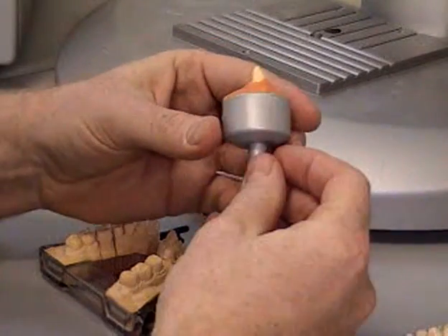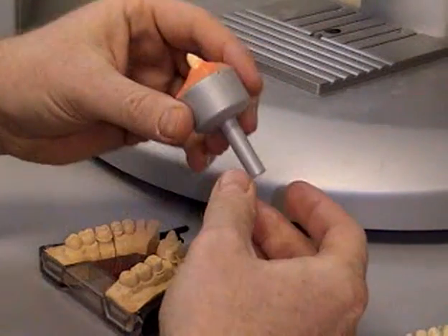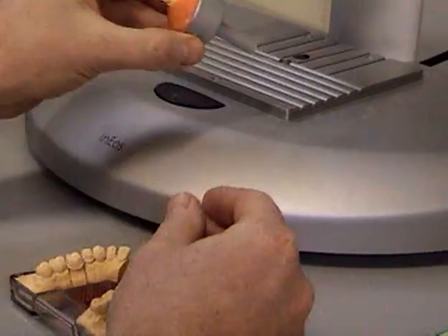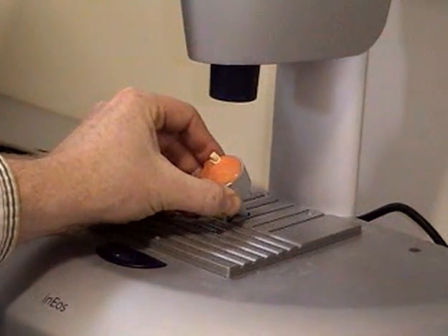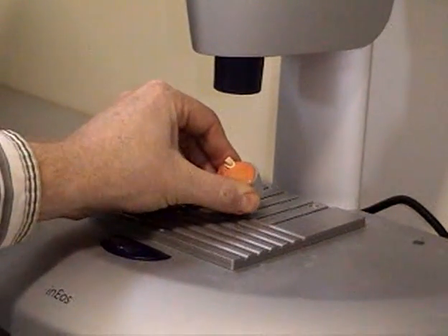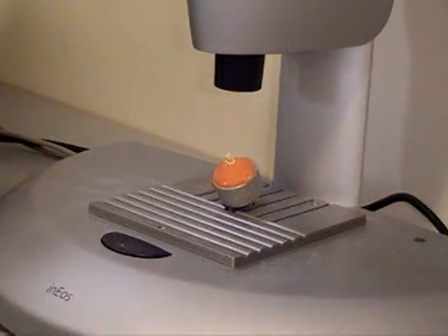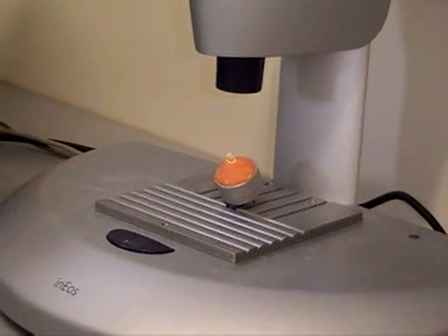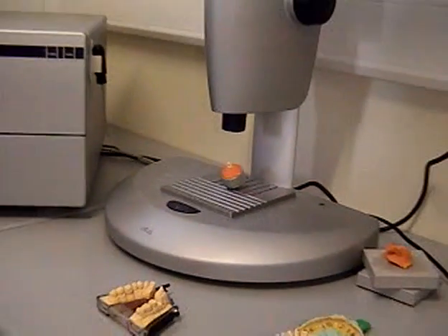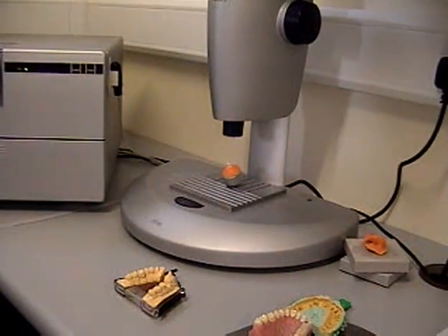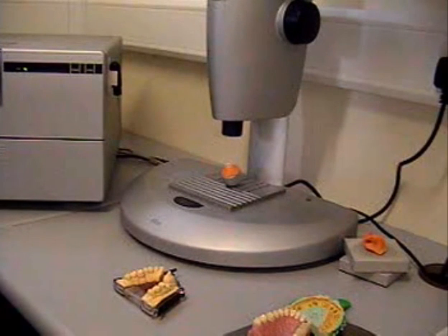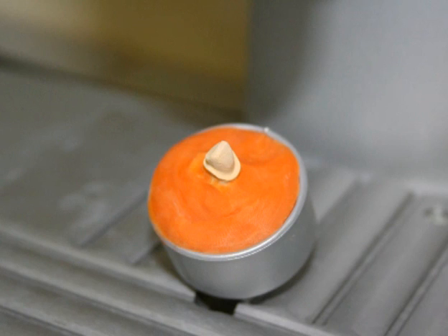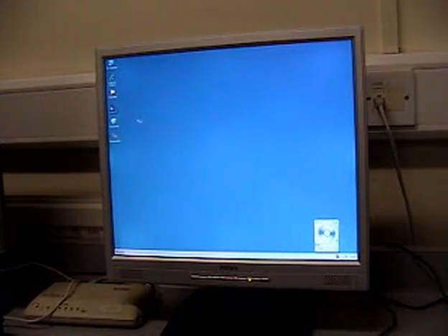Now the sharp-eyed of you will see an arrow marked onto the cup that's just been pointed out there and that should be where the distal of your preparation is and that arrow goes to the back of the scanning machine so it's distal to the distal. The reason for that is because the machine assumes that the first image that it's going to take is the distal of the prep. So when you load this up onto the software package it will automatically be labelled the correct way round.